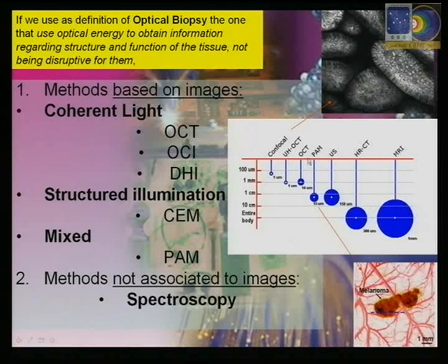But there are other applications, particularly ultrasound, not CT or MRI, which are the classical fully penetrating applications. There are applications related with ultrasound, and this is the PAM, the photoacoustic microscopy, that has a very good penetration. A very good penetration means 3 to 5 centimeters in the body. But obviously, the lateral resolution is less, although it's very good, because 15 microns is a very good resolution.